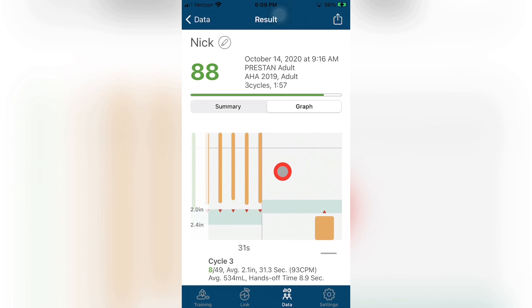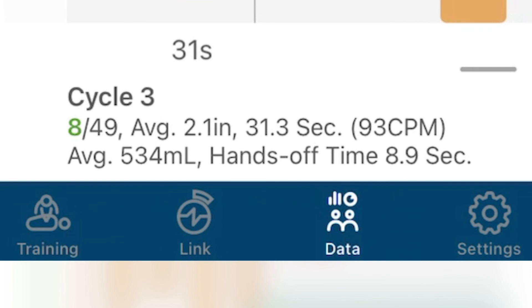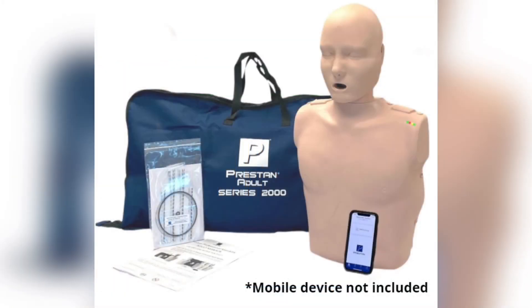At the bottom of the screen is the synopsis of the data collected for the specific cycle that is being shown in the visible window of the graph. This data includes current cycle number, ratio of good compressions over the number of total compressions in the cycle, duration of the cycle, average rate of compressions, average volume of ventilations, and the hands-off time of the cycle. For more information on the Prestan Professional Adult Series 2000 Mannequin, please reference the instruction sheet, troubleshooting guide, and frequently asked questions, available on the Prestan website at PrestanProducts.com.